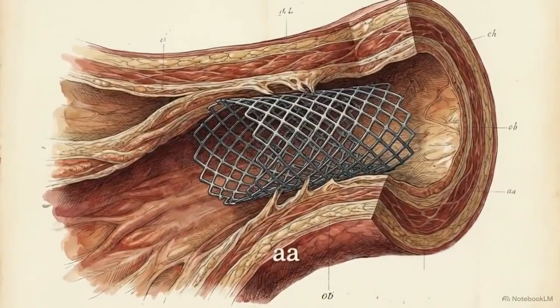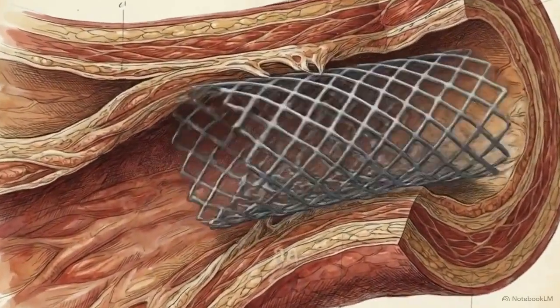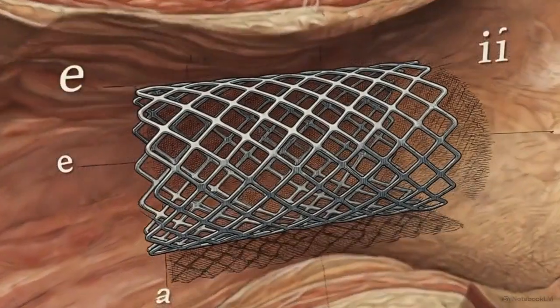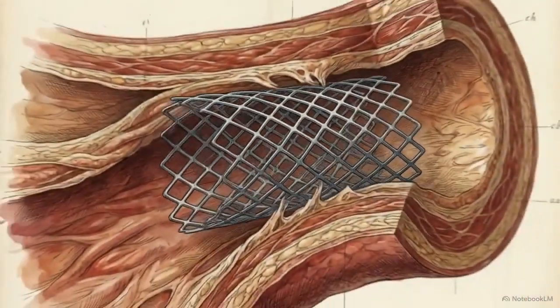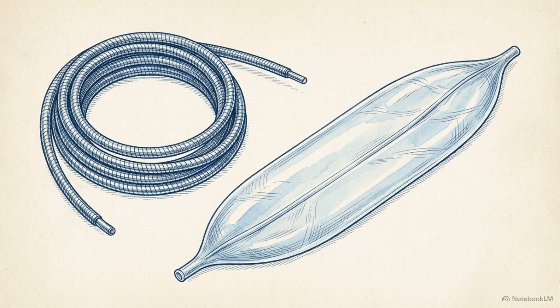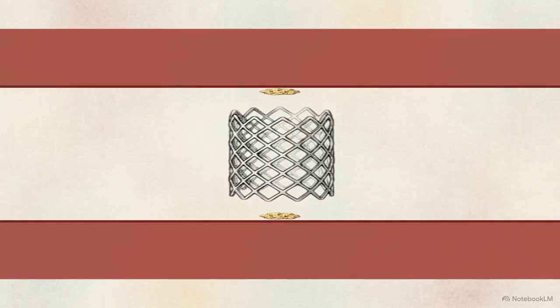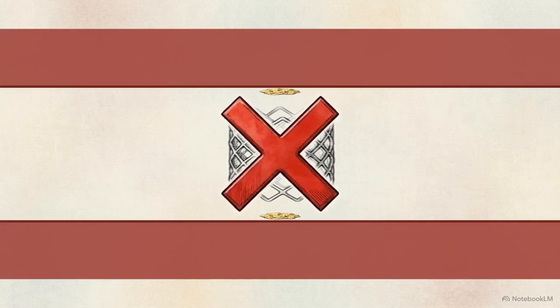The human vascular system is often treated like plumbing, but repairing it requires precise biomechanical engineering. Inside the angiosuite, clearing an occlusion or sealing a failing artery is a strict exercise in applied physics. A common clinical assumption is that placing a metal stent into a diseased vessel actively forces the artery open.